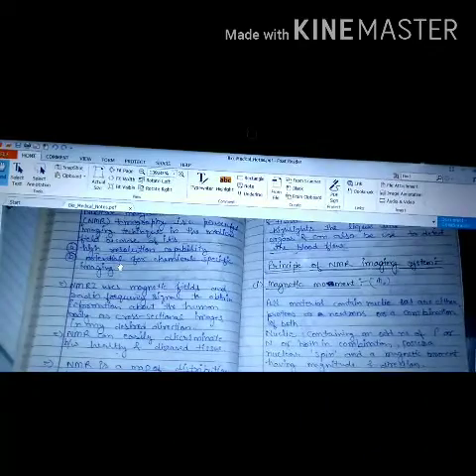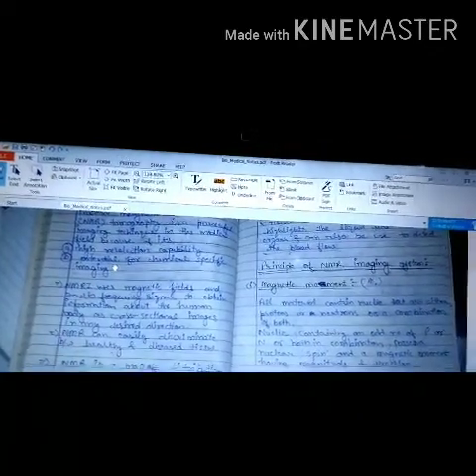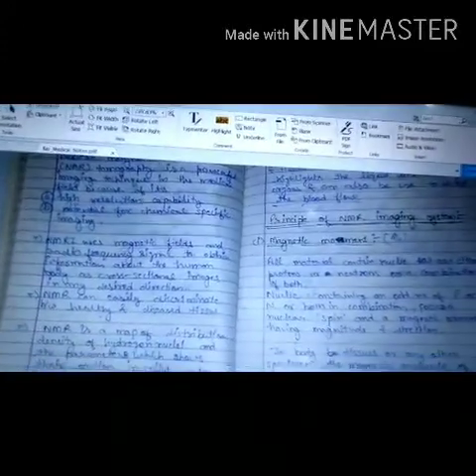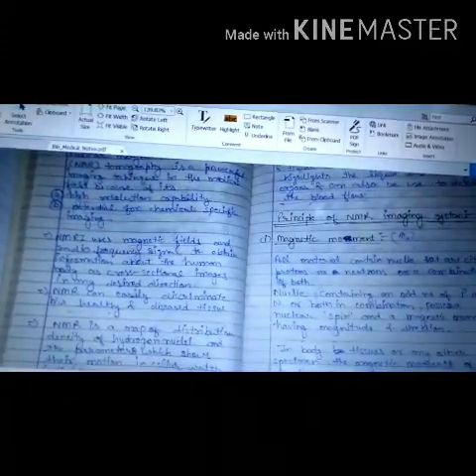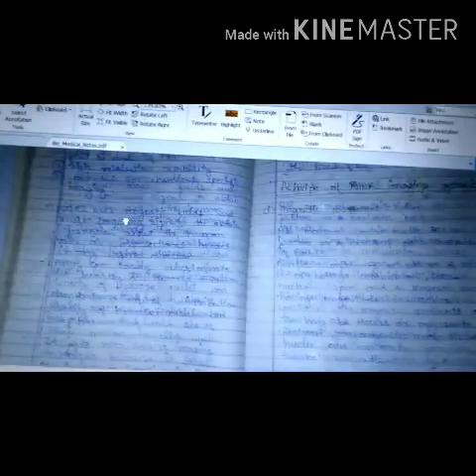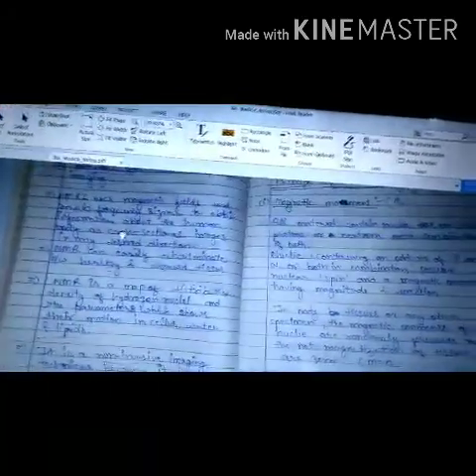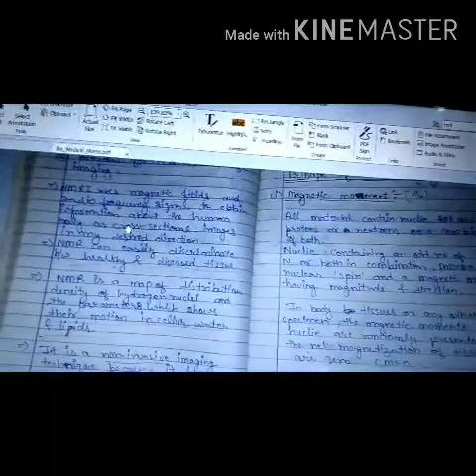It can easily differentiate between healthy and diseased tissues because the focus is on the fluids, and because of the magnetic moment and because of the magnetic and radio properties, the fluids change their individual properties which can easily be detected through NMR.